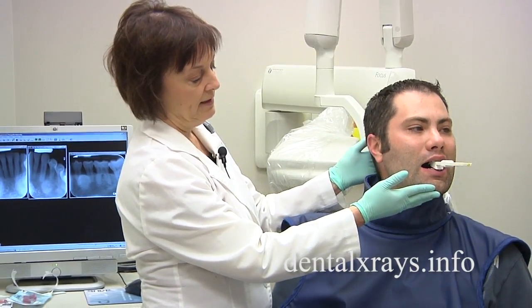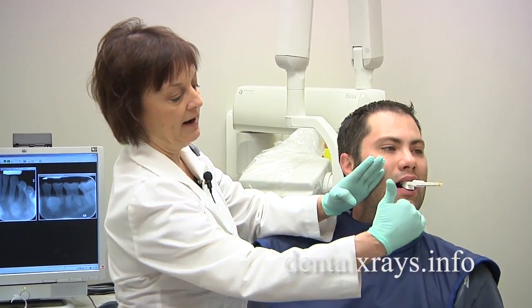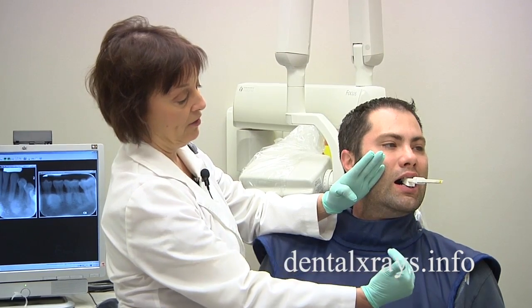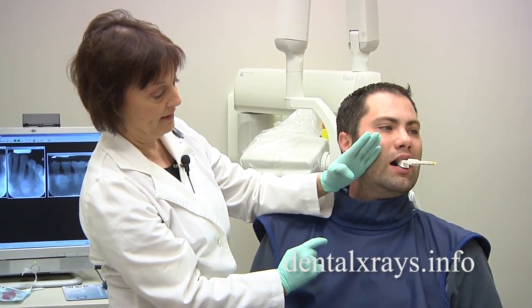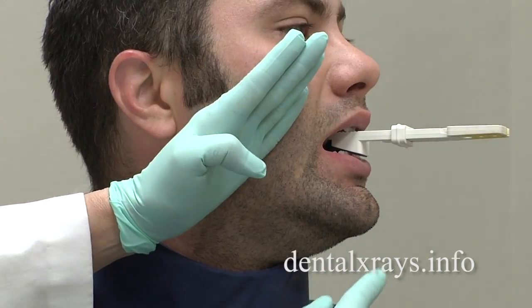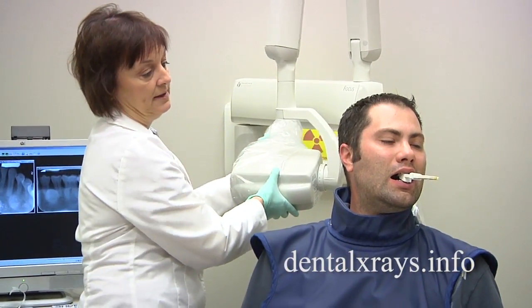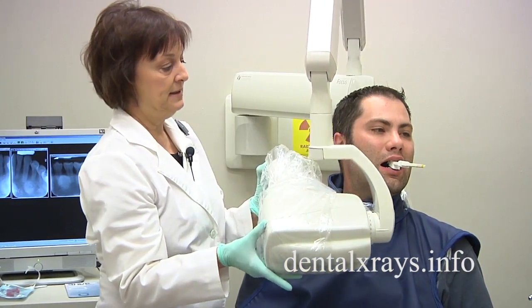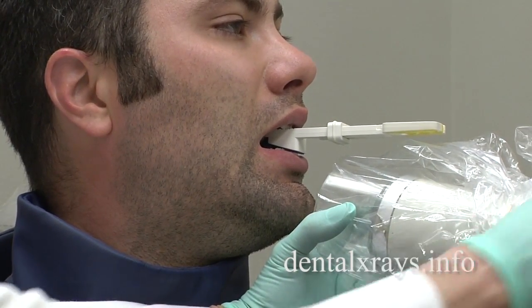I'm going to turn them to the side a little bit. By doing so, this film right now is placed on an angle about so. If we don't have our ring and bar to guide our vertical tube angle, we have to set our own. So how much do we angle the tube in the up and down motion so we do not get elongation or foreshortening on those teeth? If you follow this bite block with your x-ray cone, you'll be able to get the correct tube angle because this is set in the relationship of the angle of the film that's in the mouth. So bring the cone and line up the top edge of the cone so it's running in the same line that this bite block is running — that's about how much vertical tube angle you're going to need.